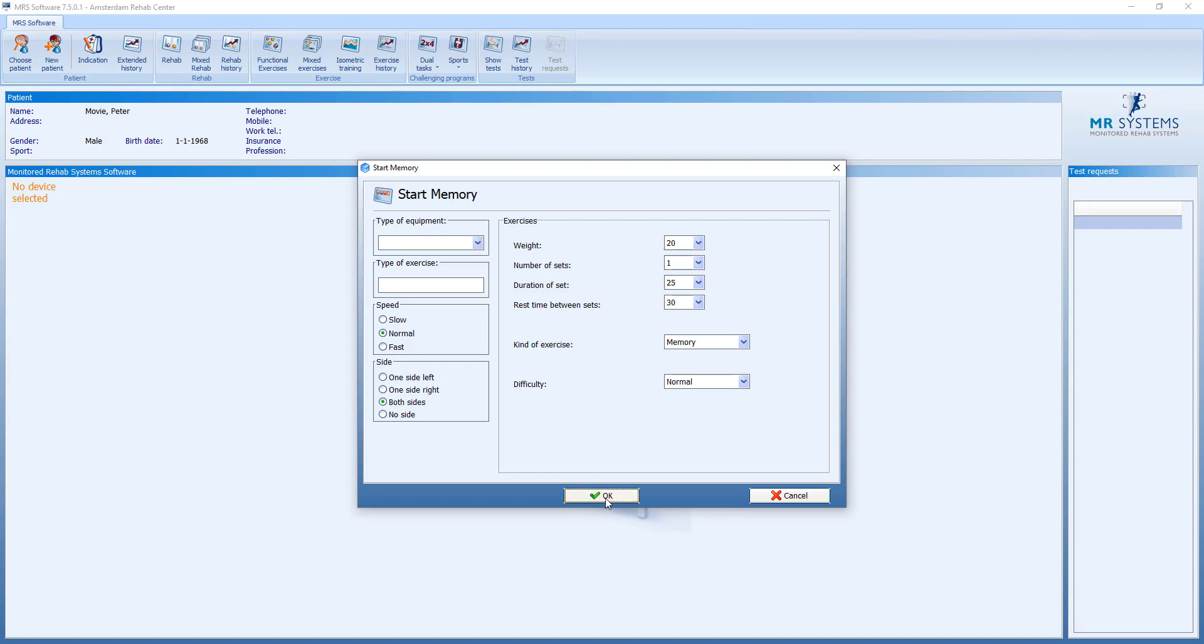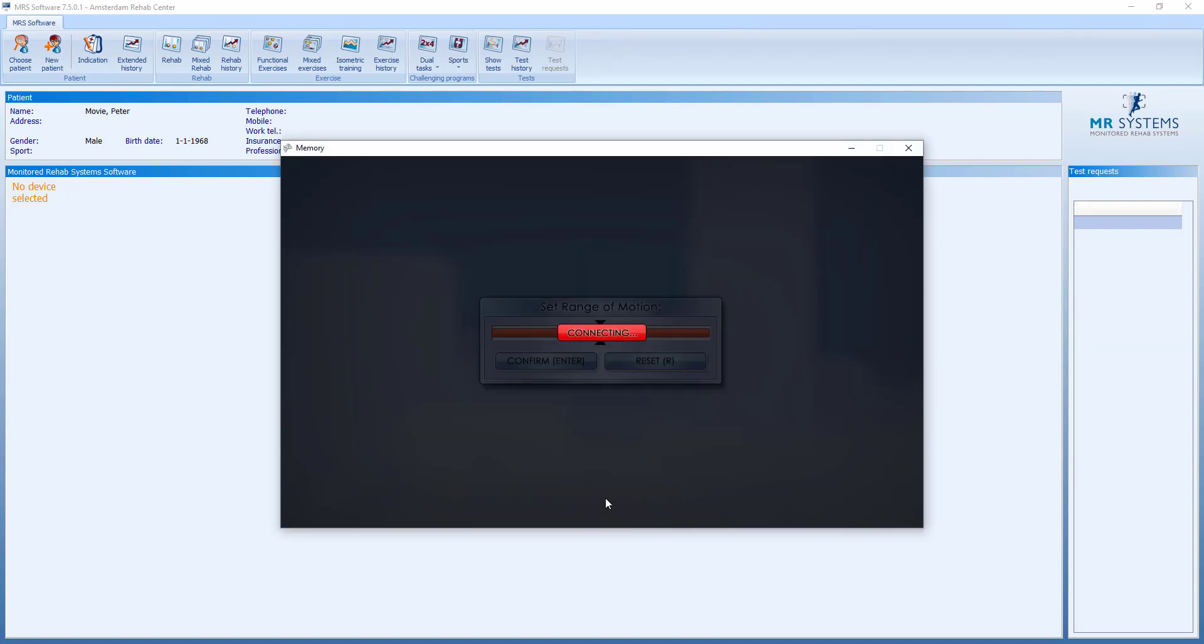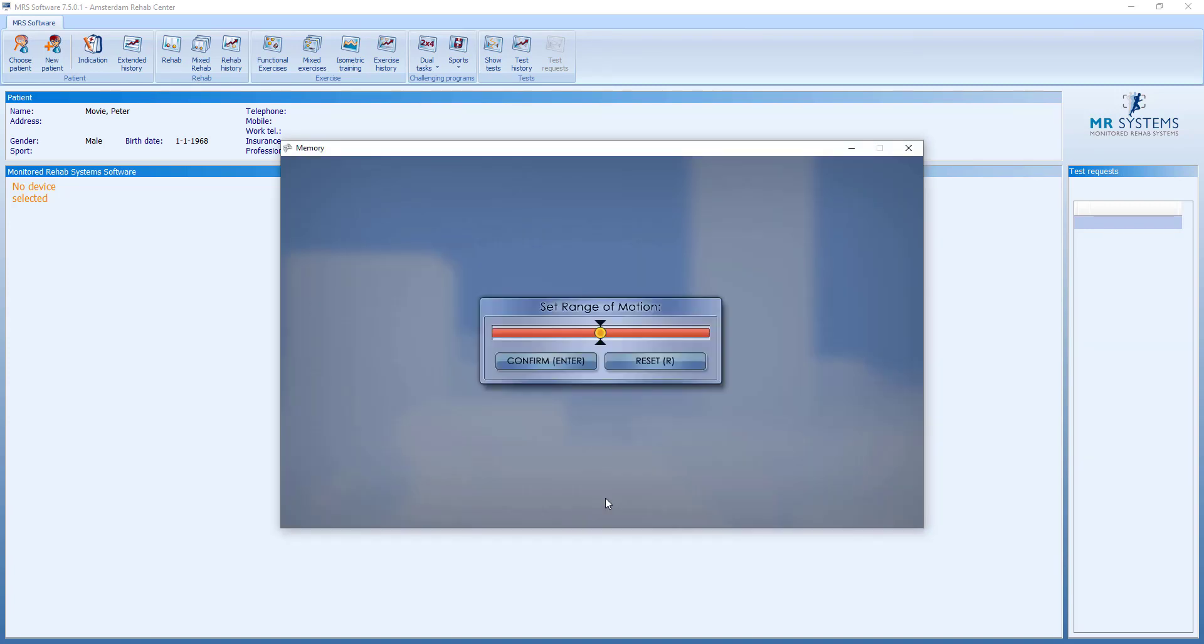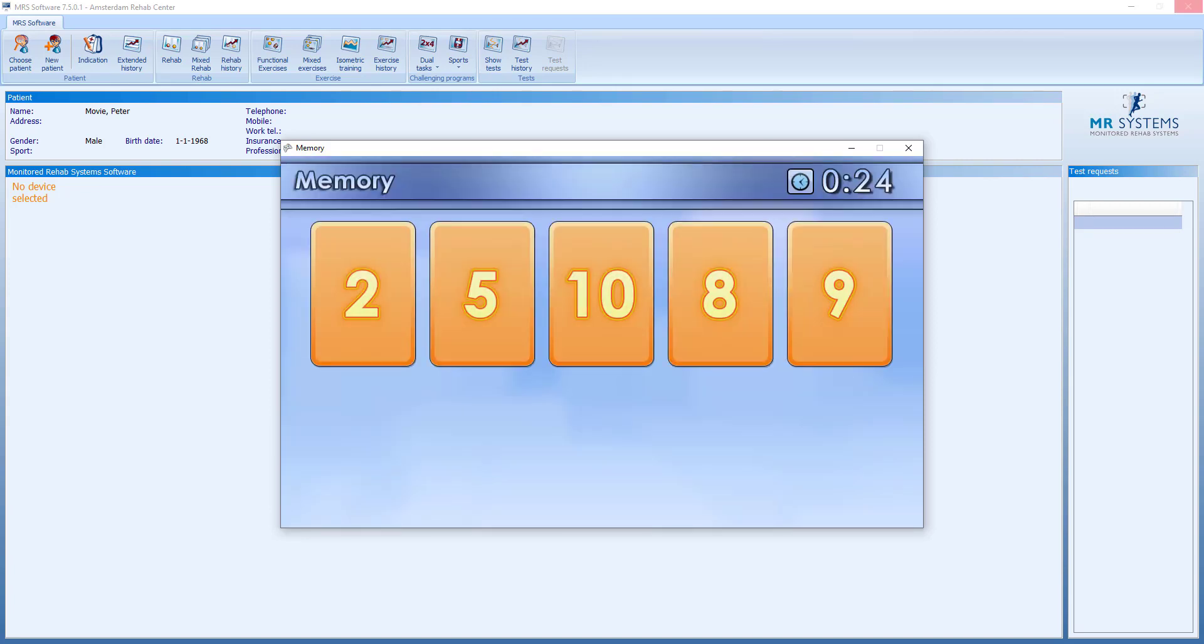And we get the question for the range of motion. We ask the patient to move one time slowly down and we are ready.